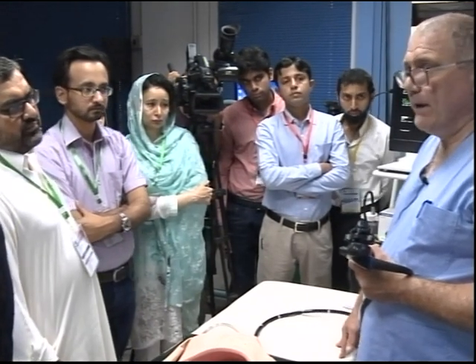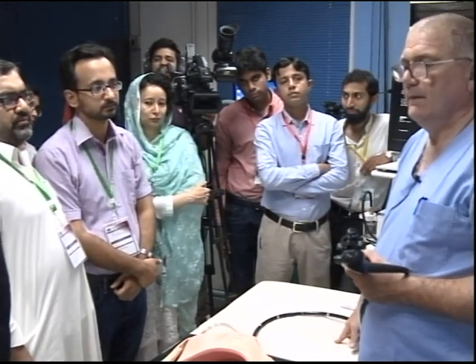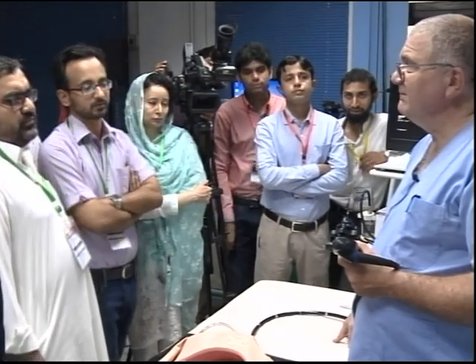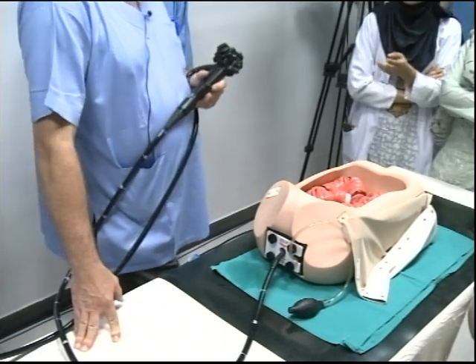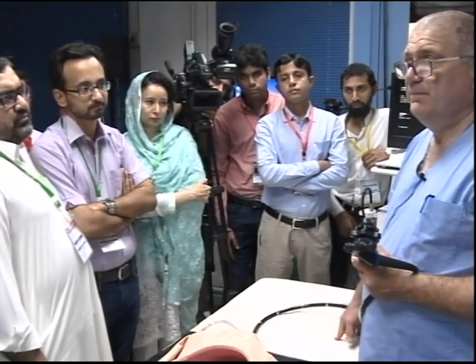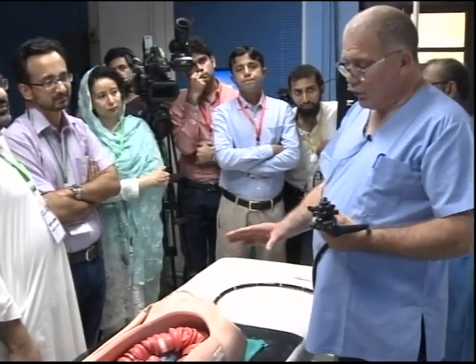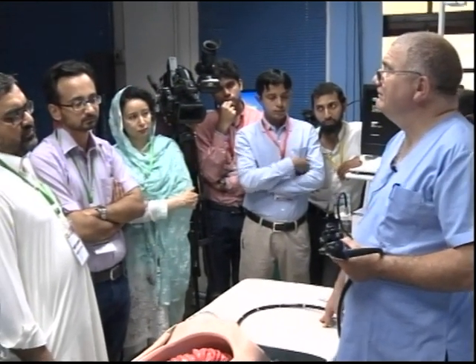The scope is still blowing, so I get my hand, it'll still blow. The problem is here because, you know, we... The scope is blowing. Well, yeah, you're quite right. There is a problem with the scope. Not quite. The scope is blowing and the bowel is not insufflating. What can be the problem?